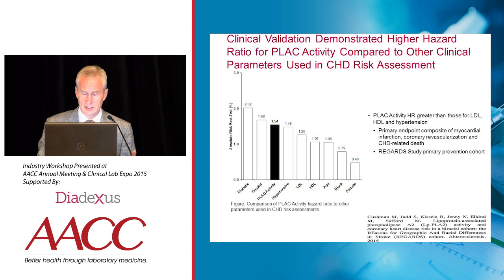And I think this assay plus our risk assessment with lipids and other factors helps. You can see in terms of absolute post-test risk, following patients forward, that the plaque activity assay of the lab measures is actually the strongest independent predictor.